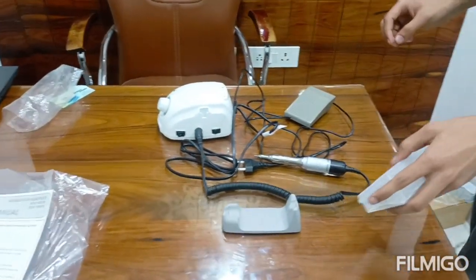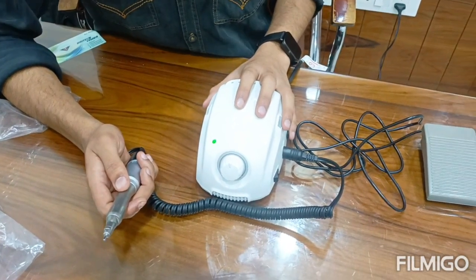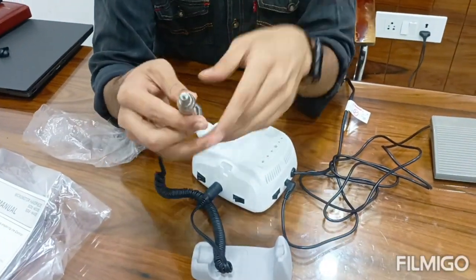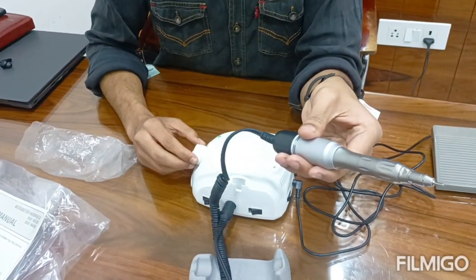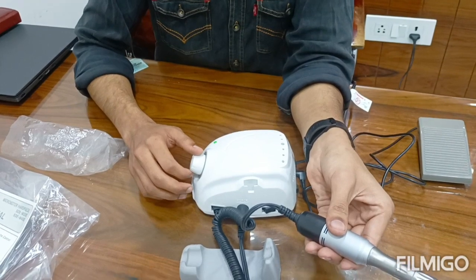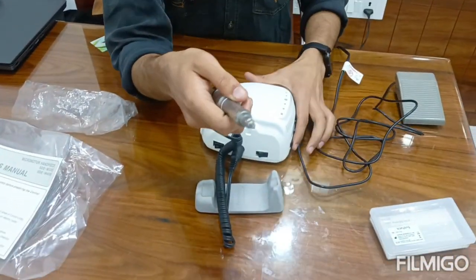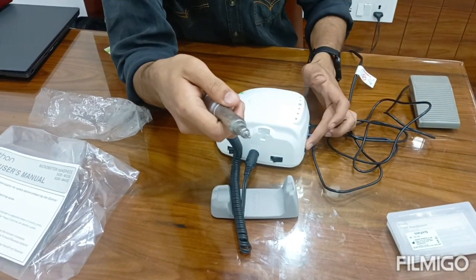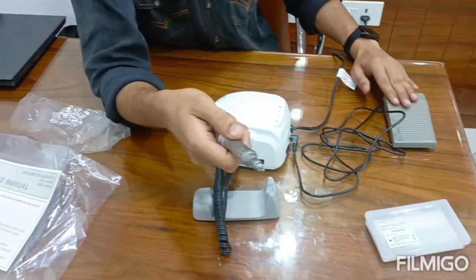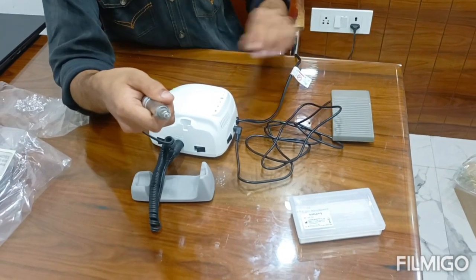Stand. So friends, you can use this motor automatically and manually. If you want to use it automatically, start it now — you can control the speed as well. Speed intensity control is available. Automatic mode is turned off by this switch, and manual mode is on. You can control it by foot pedal, and intensity control is also available.